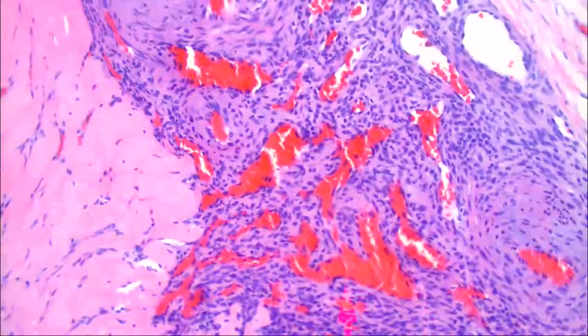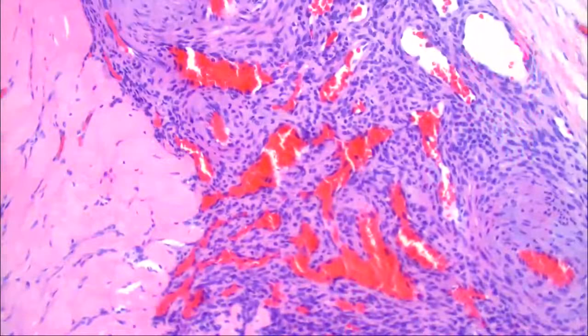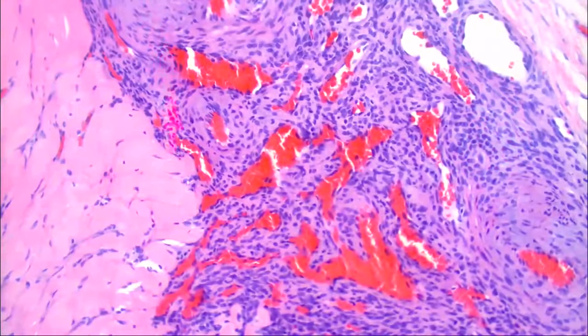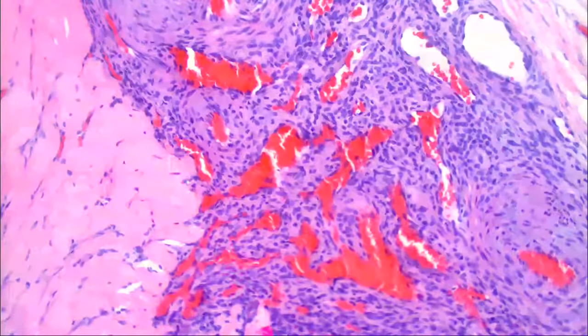Well, there's a lot of red cells. We've got vascular spaces. So when I think about spindle cells, I think about smooth muscle maybe. Good. So this part is vascular. So there's a vascular component to this, and that actually goes along with this lesion.